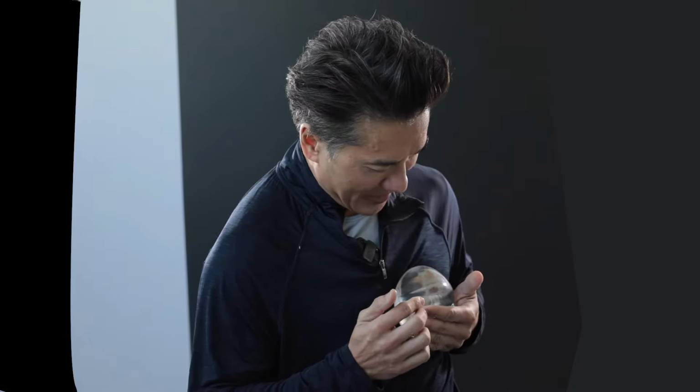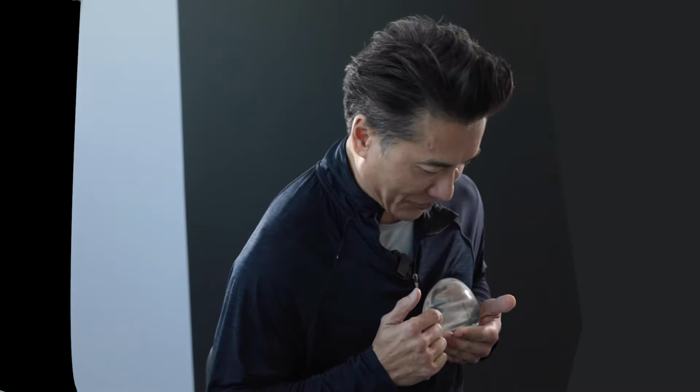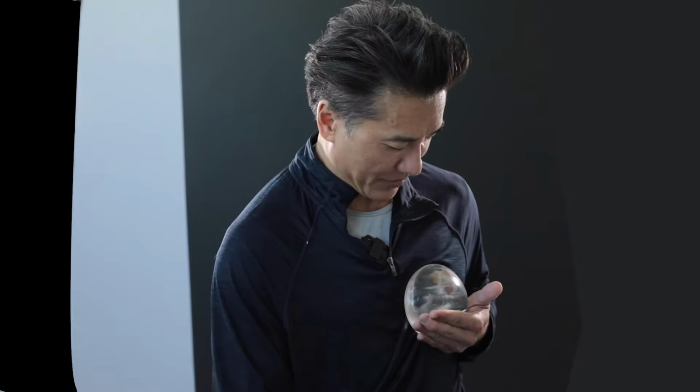And as you can see, if it doesn't sit correctly, let's say, for example, the patient bends over and the breast falls from their body, and then they can see this right here, the rippling, they can actually see it through their skin. And so that's something that obviously would be bothersome for a lot of patients who have breast implants. So how do we deal with rippling?